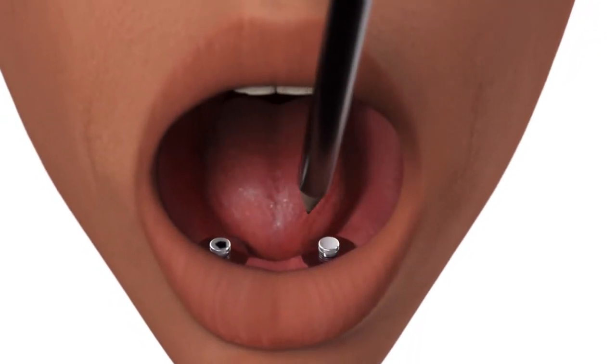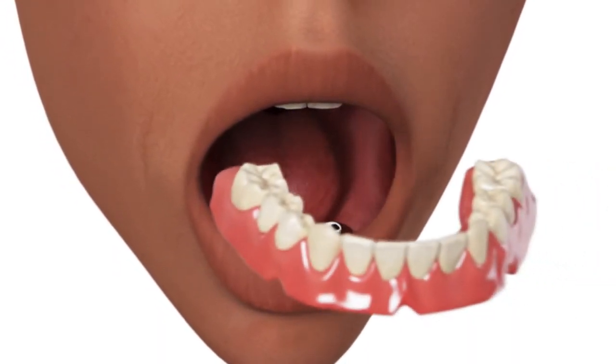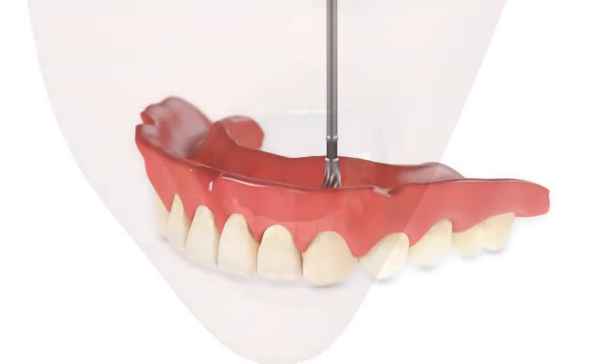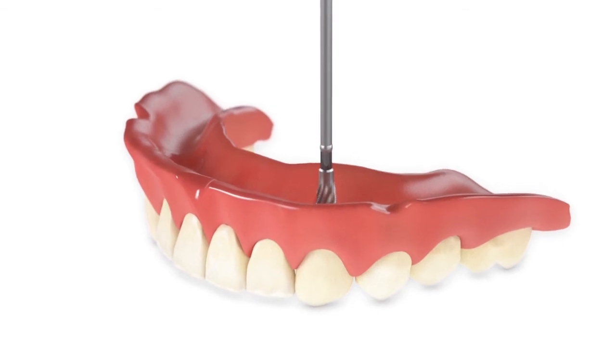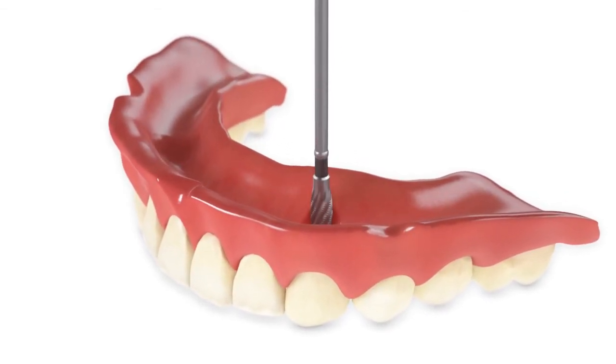Place a transferable mark on the top of each OD Secure housing cap and seat the denture. Prepare a recess in the denture at each mark to accommodate the housing. Ensure that there is no contact between the denture and the housing caps.